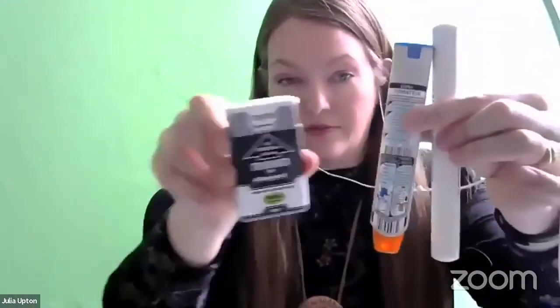Okay, great. So they're all given in the same place, but they all have quite a different form factor that hopefully meets different people's desires. Right. Now, we did get a question from Natasha, and I guess this would be the EpiPen device: how hard do you need to press on the orange to get the orange piece down? And then maybe you can address that with all of them. Like, how hard do you need to press?